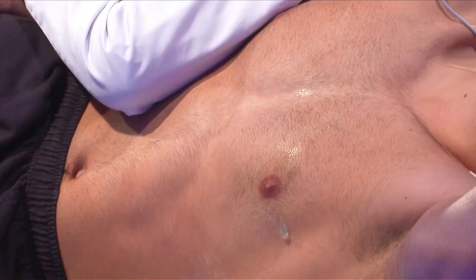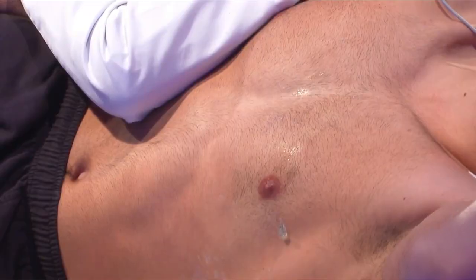It's not typical of any coronary artery lesion. It affects all the segments of the apex, and in this specific case also the medial segments of all LV walls. Therefore, a non-coronary artery disease pattern.